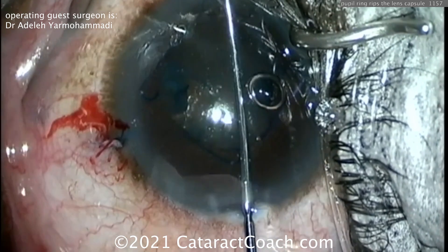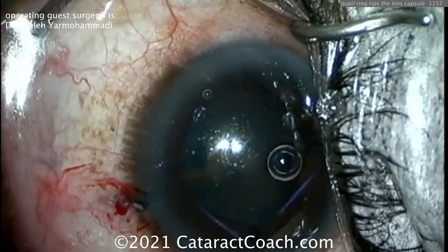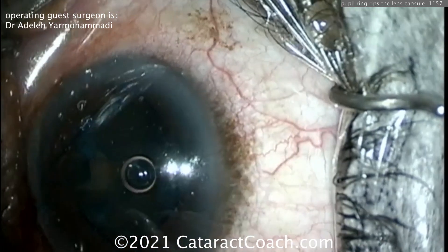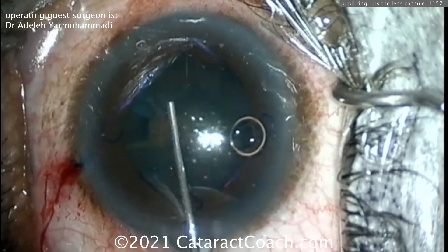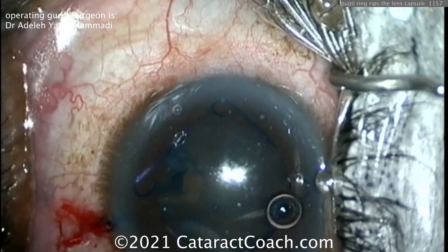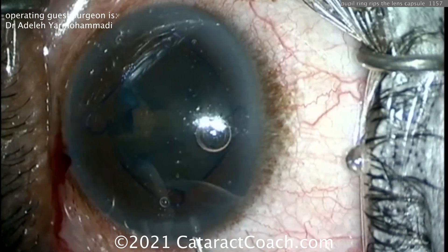You're really hindered by poor visibility because there's too much oil in the tear film. You need to get all that cleaned up — you shouldn't be working in all that oil; it ruins your view. The patient appears to be under topical anesthesia. More viscoelastic is being added — smart move, filling up the anterior chamber. I wish someone would just hose all that oil off the tear film with BSS.